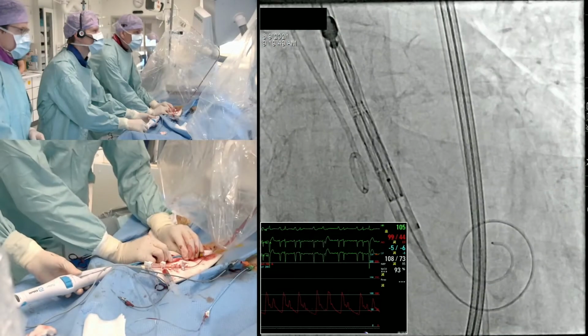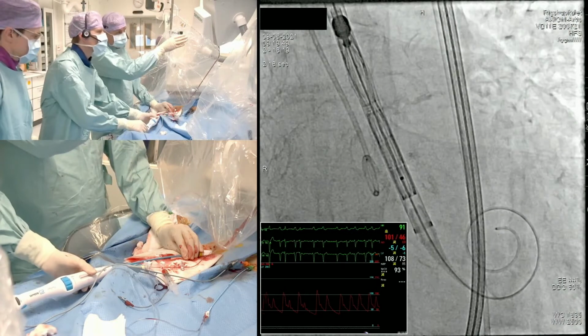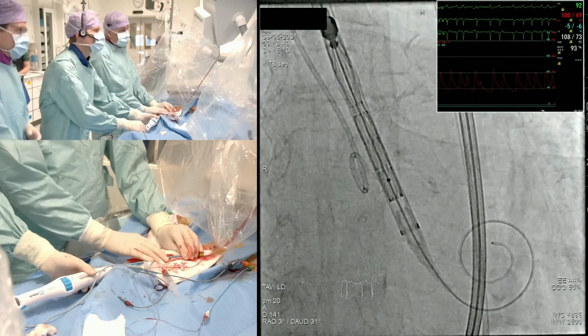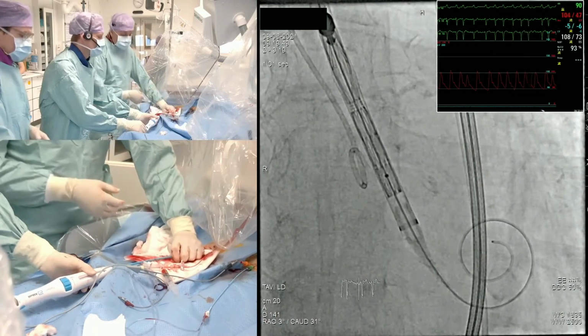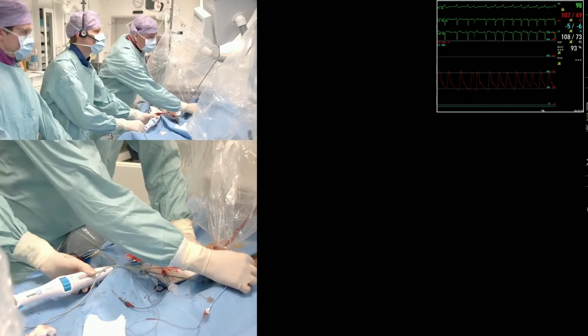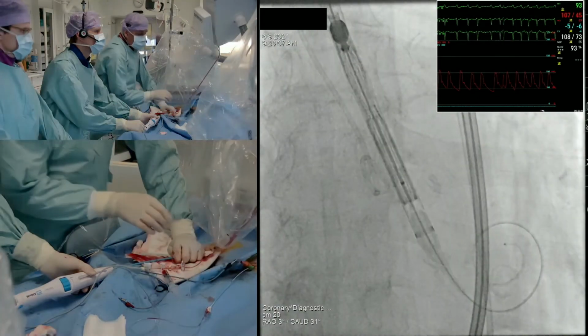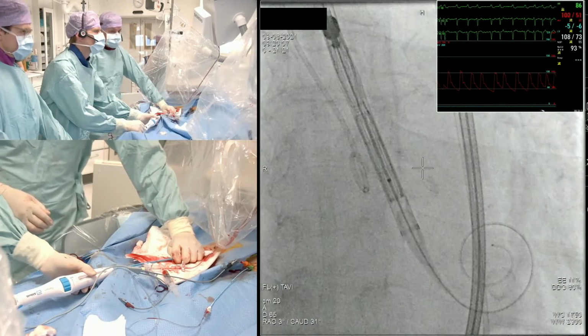Yeah, I think we have one more or less isolated. So again, in the middle of the stent frame, it looks like one is isolated on the right-hand side of the screen, and the 2 others overlapping on the left-hand side of the screen. This should hopefully give us commissural alignment afterwards, which is important both to be able to access the coronary arteries, but probably also for the durability of these valves.